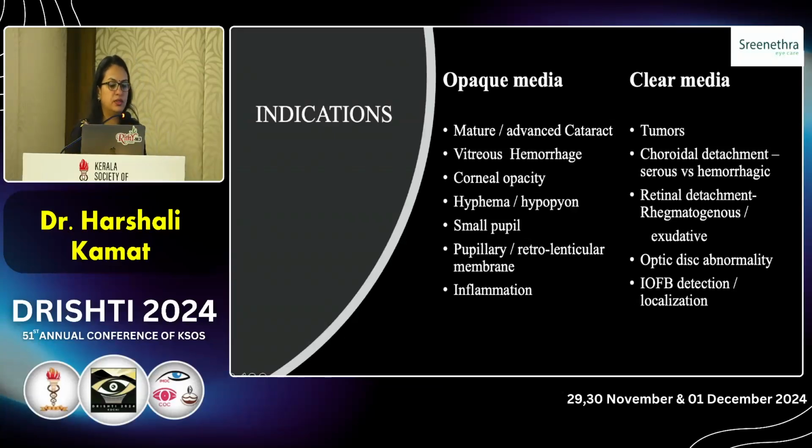It's a go-to imaging in opaque media, in cases of mature or advanced cataract, vitreous hemorrhage, corneal opacity, hyphema, hypopyon, small pupils, retrolenticular or pupillary membrane, and in cases of inflammation. There are other indications in clear media, but they're more in the retina clinic.